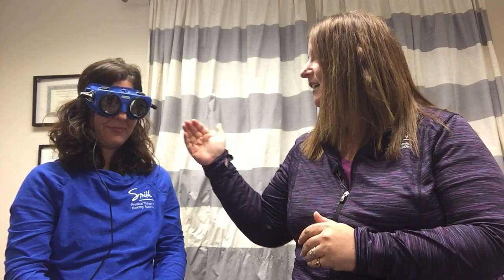So what it does is it magnifies the eye. Like everything is blurry. Your vision, exactly, except it comes into focus like here, really close, but far away, and that's to help prevent you from staring at something to fixate on an object. That's how people with vestibular problems will cheat with these tests. And what we look for here is if you have an abnormal nystagmus, which is like a bouncing movement that we see in the eye.